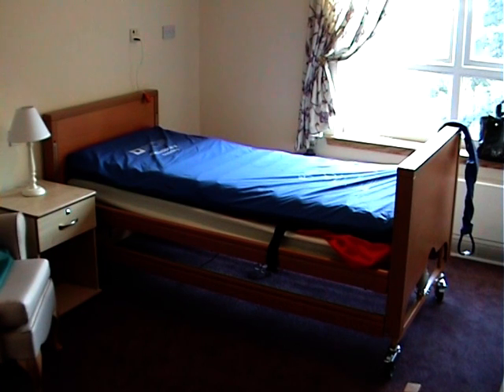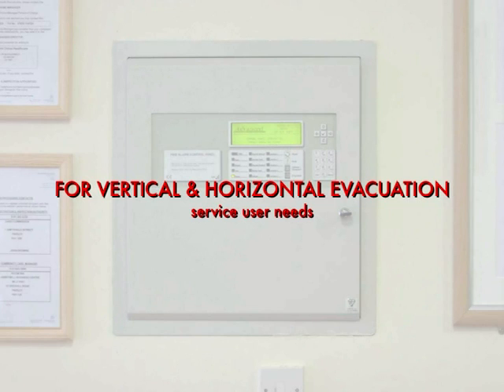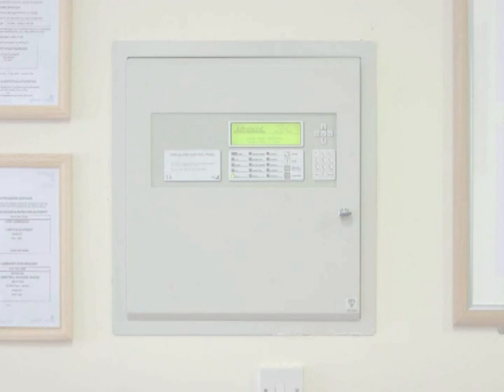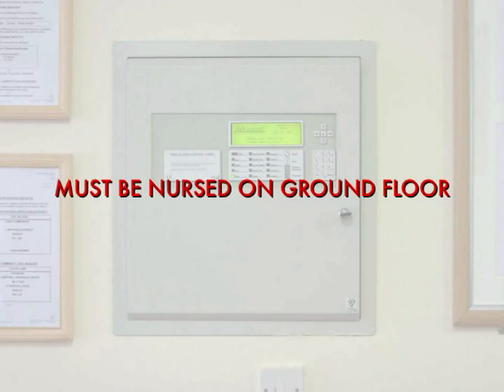High risk service users are on an airflow mattress or require hoisting equipment for moving and handling. For vertical and horizontal evacuation, the service user needs assistance by a carer and the ski sledge. The evacuation system should be used for all service users within this risk factor. For vertical and horizontal evacuation, any service user within your care centre who has the classification of bariatric nursing must be nursed on the ground floor of your home.